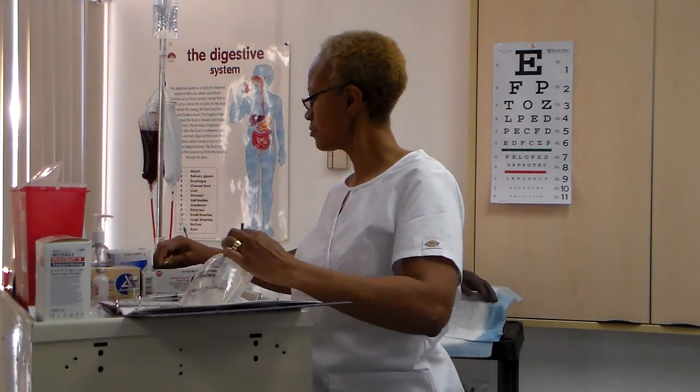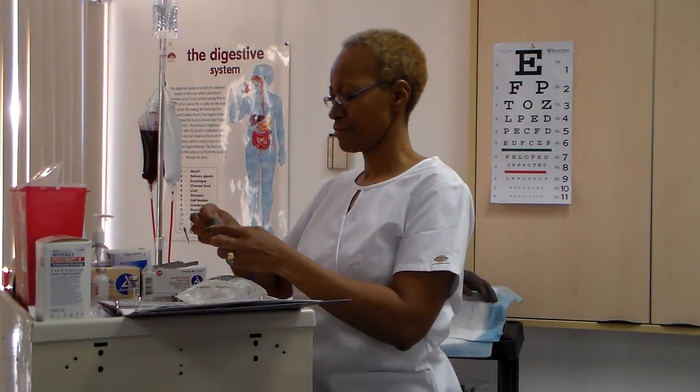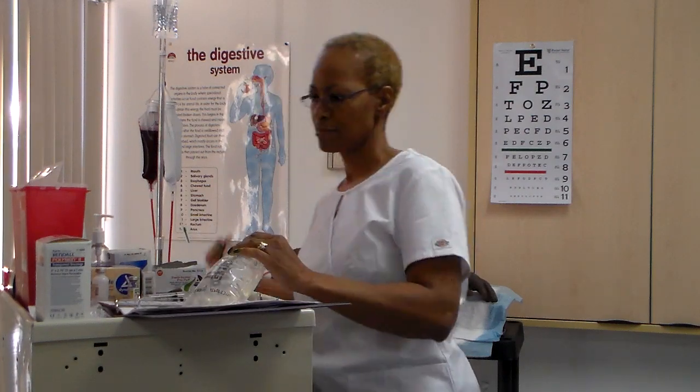Solution in a bottle. Locate injection site on IV solution bottle, which is often covered by a metal or plastic cap. So if you don't have a bag, you could have a bottle, and at the end of the bottle is a metal cap, so you would identify that metal cap. It looks similar to this. Wipe off port or injection site with alcohol or antiseptic swab. Remove needle, cap, or sheath from syringe and insert needle of syringe or needleless device through center of injection port or site.